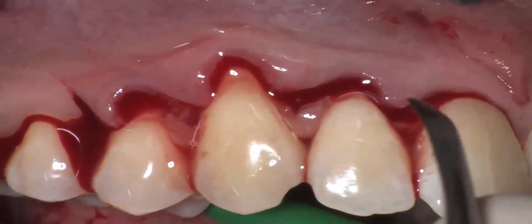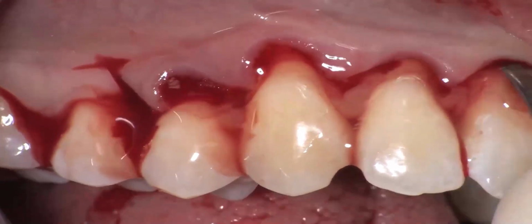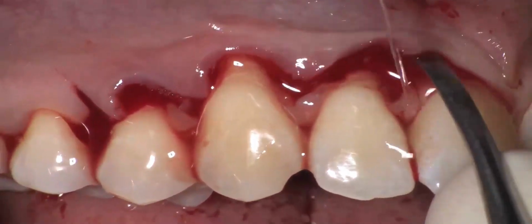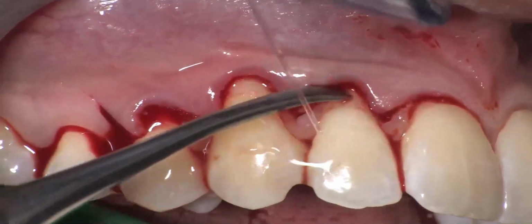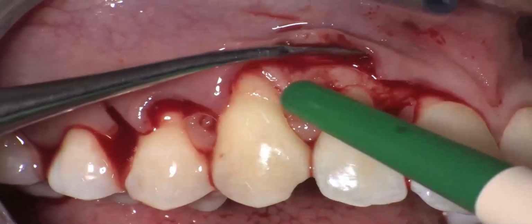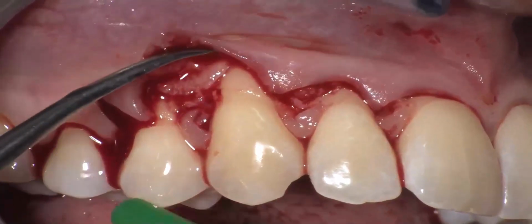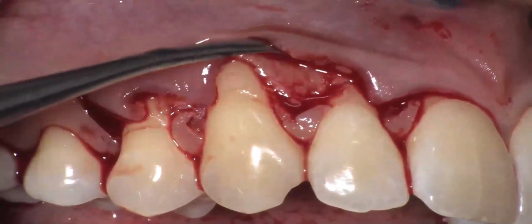a slight full thickness flap elevation is made at the level of the central in order to be able to complete coverage of the lateral. So now full thickness flap elevation in order to expose the bone has been made in all treated gingival recession.